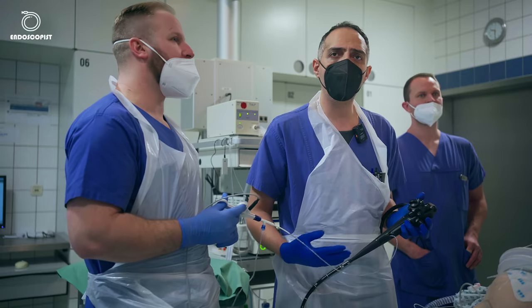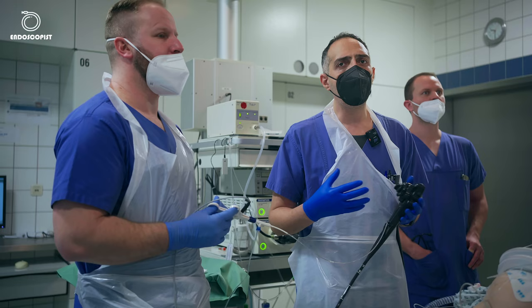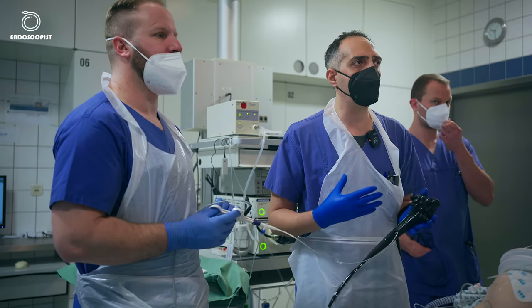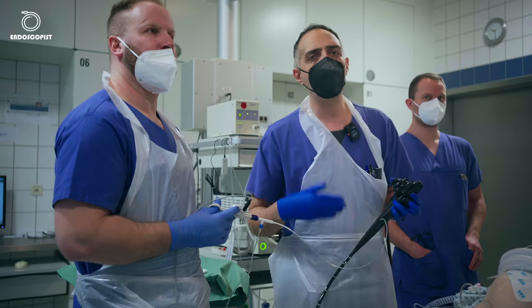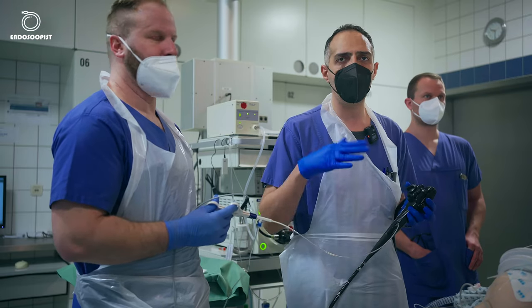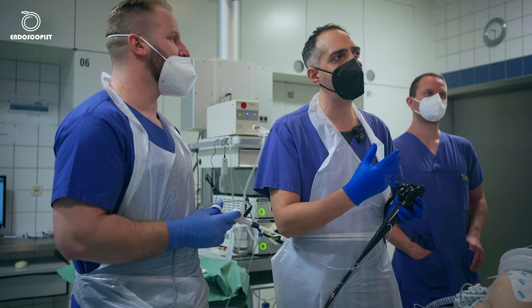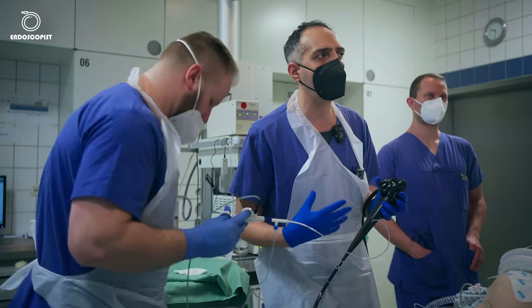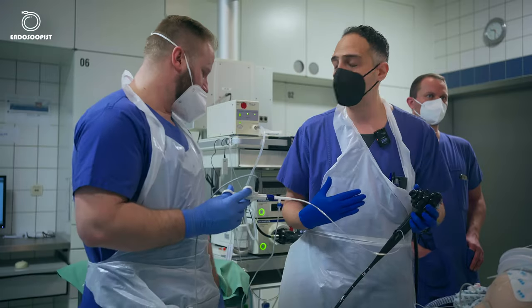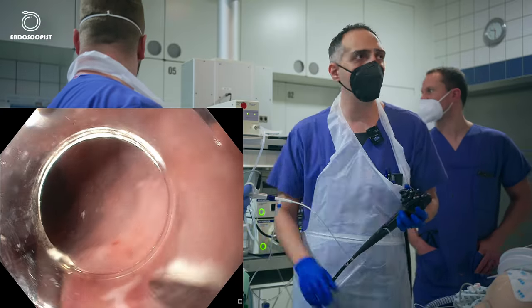So how to know that we are deep enough with the tunnel? Some people make it very sophisticated. I keep it simple. It depends for me on how it looks endoscopically. So I see the bulge of the submucosa, the blue that we inject in the stomach. And from the measurements of the scope, usually I'm quite sure that I'm already in the stomach, and then I will start my myotomy. I will start the video again so you can see what I mean.